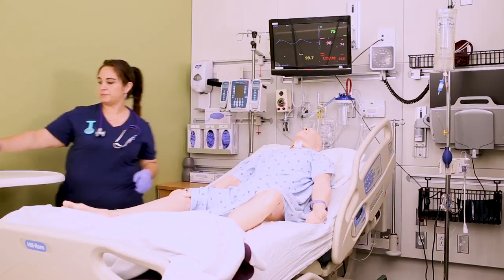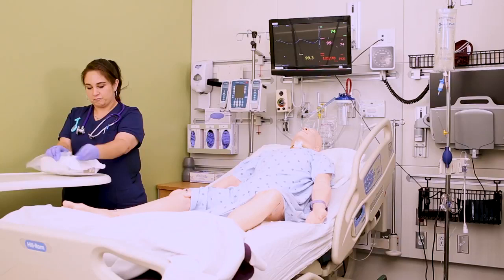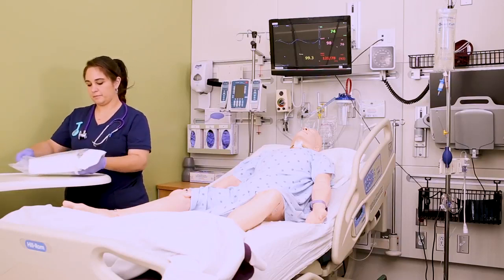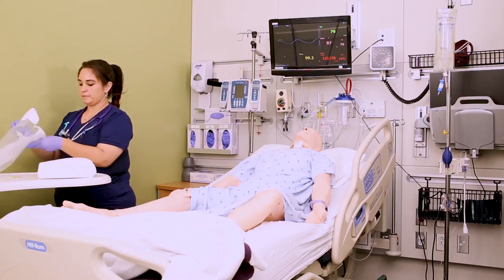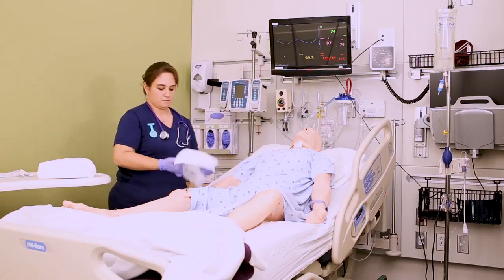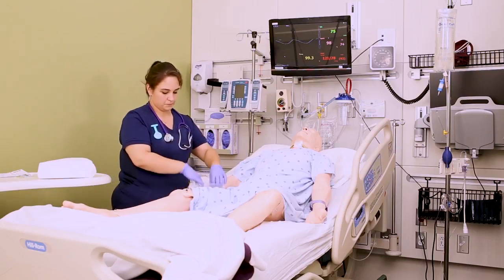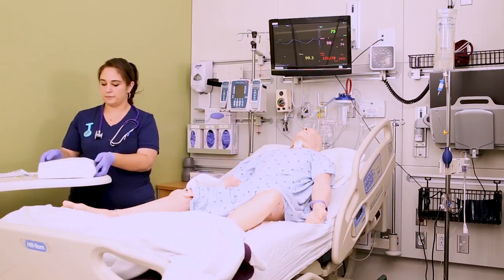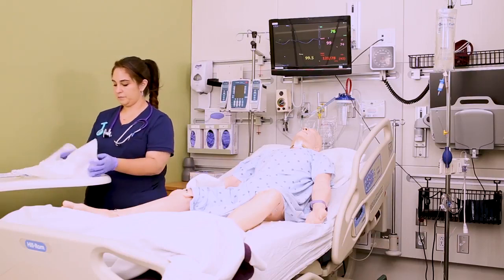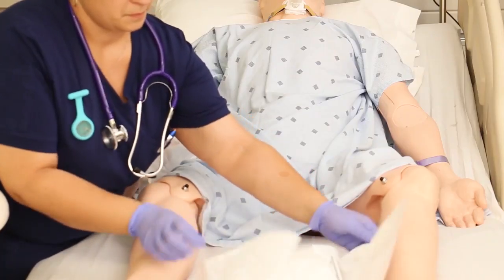Open the Foley kit and remove it from its plastic bag. These plastic bags are really nice because you can fold the top over and make yourself a little trash bag. Place it next to the patient's hip close to you so you have a place to throw trash without contaminating your sterile field. Open the sterile kit on the bedside table away from you, then pick it up from the bottom and place it between the patient's legs, reminding them not to move their legs or touch the kit.